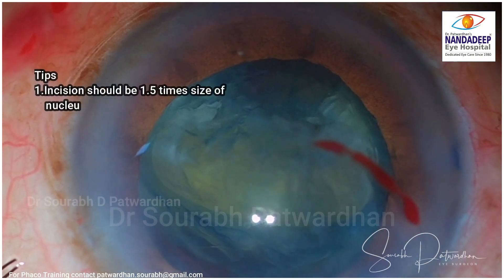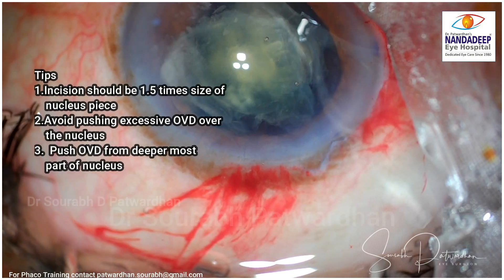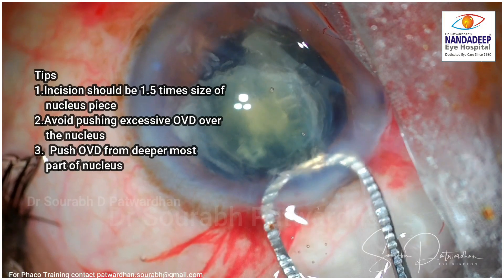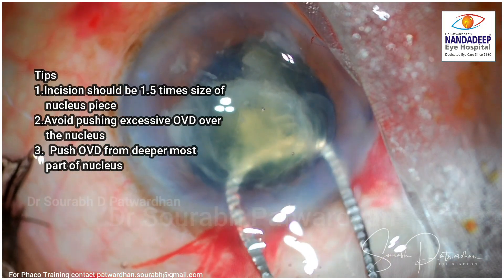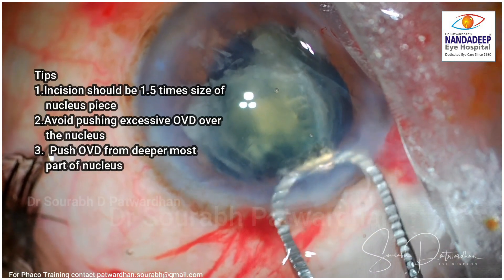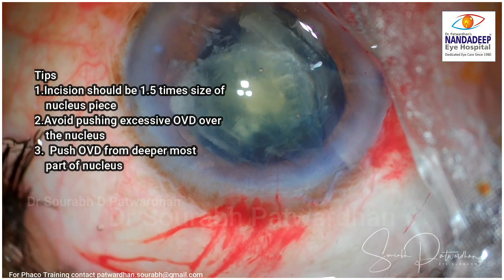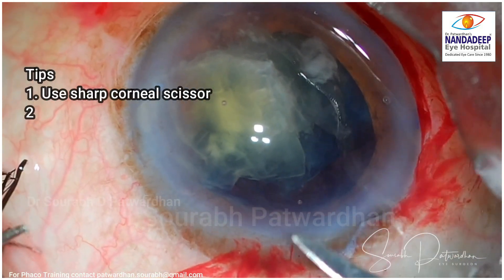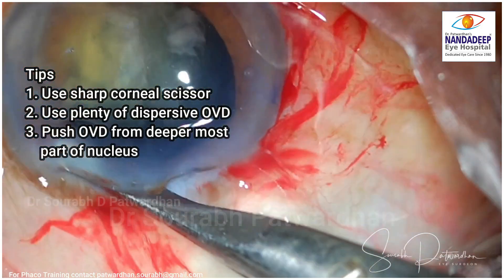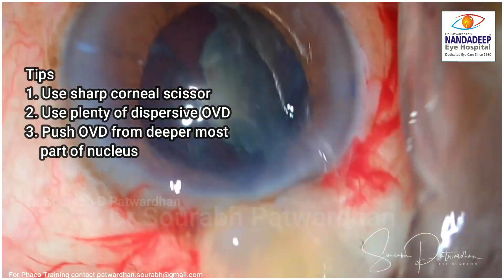The most important mistake made by beginners is that they make the incision the same size as the nucleus, but you have to make it at least 1.5 times the size of the nucleus piece — remember the nucleus piece is not flat, it has volume, so you need a larger incision to take it out. Don't use wire vectis directly; if you want to use wire vectis, use a sandwich method to take the nucleus out. While enlarging the incision, use a sharp corneal scissor and make sure you use plenty of dispersive OVD — 2% HPMC — to take all the pieces out.